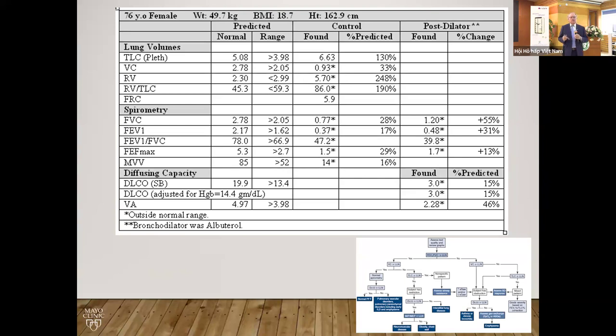Ok. I was going to point out one more thing in these examples. Down here at the bottom is a flow chart. Now, in the new 2021 interpretation standard, they separated the flow charts into spirometry, lung volumes, and diffusing capacity. This particular flow chart is from my textbook, and it's an all-in-one flow chart. The only thing that's different that I'll probably change in the next edition is I just list interstitial lung disease here. I would put simple restriction, and I list diseases down here, and I would put complex restriction. But otherwise, it's an all-in-one flow chart rather than having separate ones.